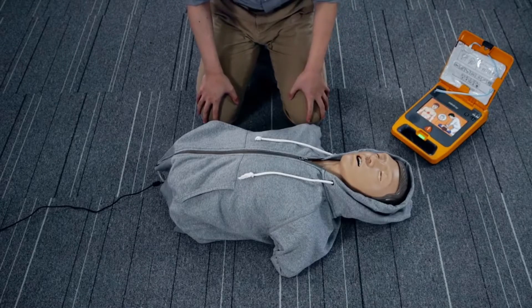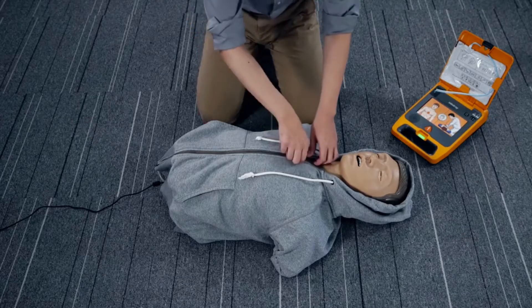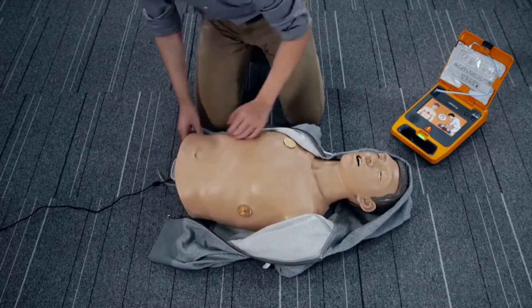Powered on. Stay calm. Follow the instructions. Remove clothing from patient's chest. Apply pads as shown on pads.